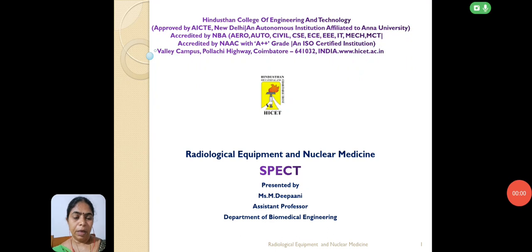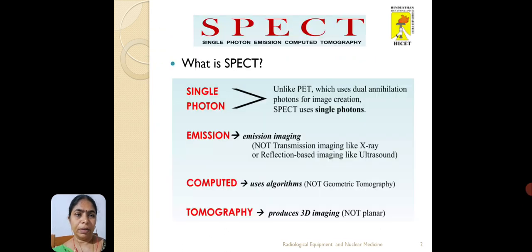Welcome. In this video we are going to discuss SPECT. What is SPECT? SPECT, Single Photon Emission Computed Tomography.